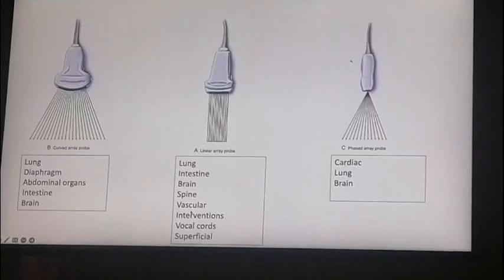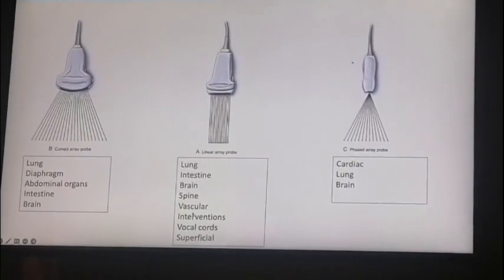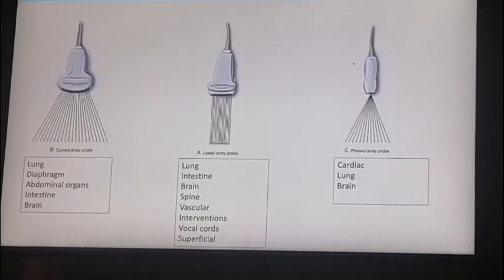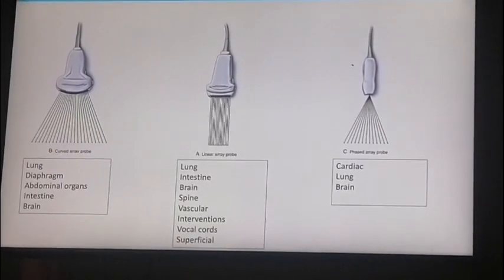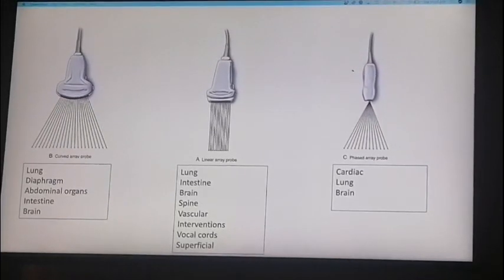We also use it for vascular assessment, for insertion of peripheral and percutaneous lines in premature infants. That's very tiny, we are talking about millimeter depth for ultrasound-guided vascular access.